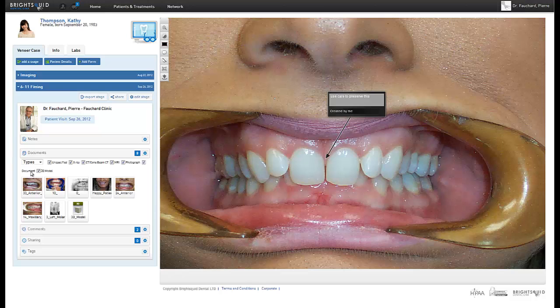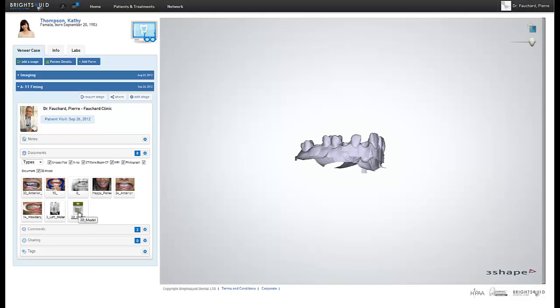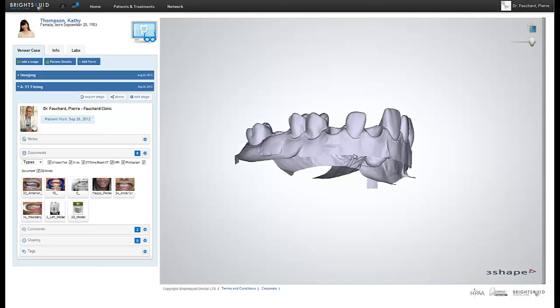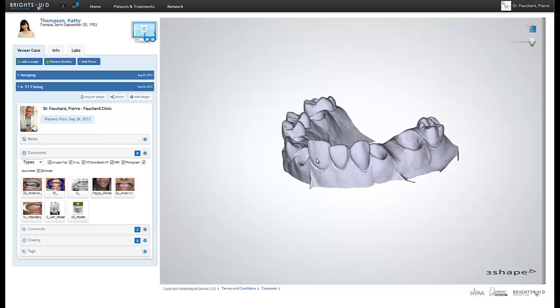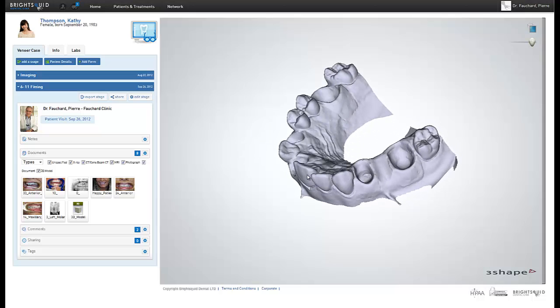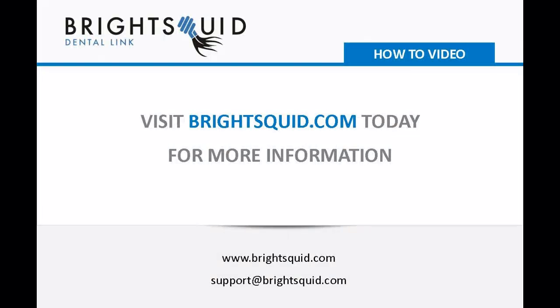Note that non-image-based files may also be uploaded to DentalLink. Files such as Word documents, Excel spreadsheets, and PDF documents can all be uploaded and shared via DentalLink. Clicking on any of those types of files will initiate the download of that file. DentalLink also supports advanced file types such as 3D models and DICOM and CT scans. For more information on managing advanced file types, please see our Help and Support Center for those related videos.